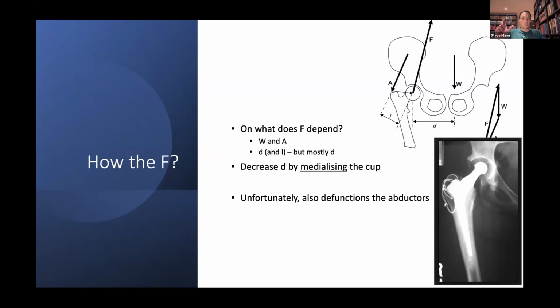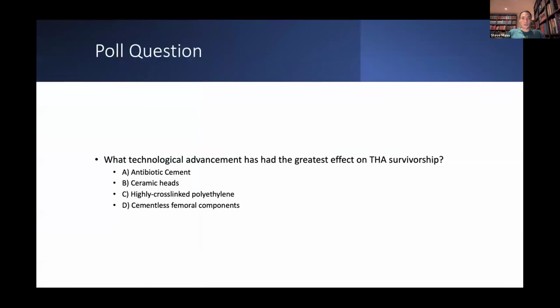They're no longer at an optimal tension. And so to overcome that, he did an osteotomy of the trochanter. That was part of his surgical approach. And when he reattached it, he took it more distal on the femur. And by distalizing the trochanter, he stretched the abductors back out to where they were at an optimal working length. And that's what gave him a successful hip. So that's the Charnley low friction arthroplasty. As we said, absolutely revolutionary operation of the century, changed the game when it comes to hip replacement.